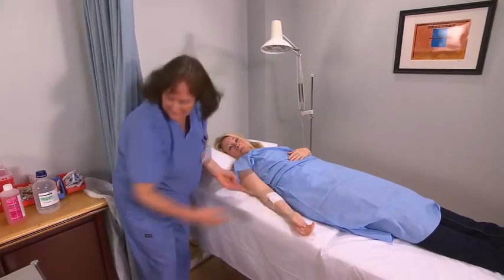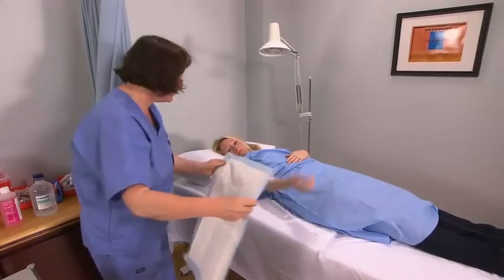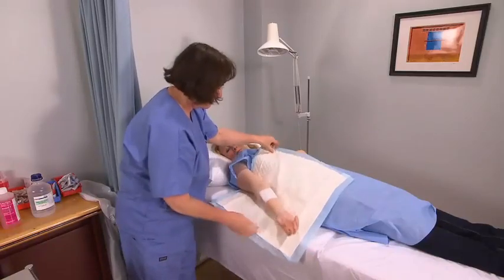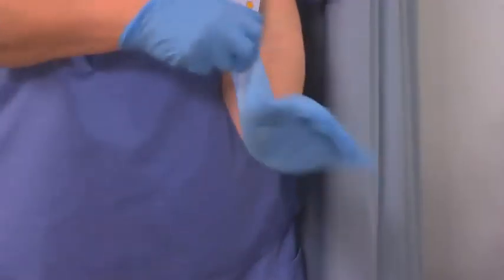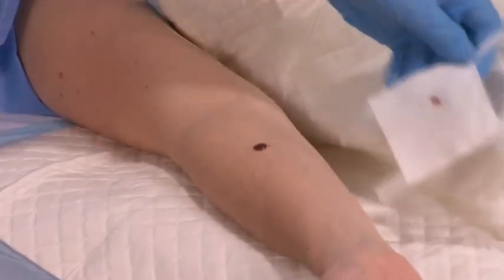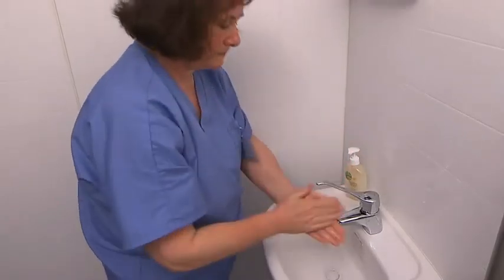Expose the site for surgery. Place a disposable drape under the region to be prepared. Ensure that a waste receptacle is nearby for collecting any used equipment. Put on non-sterile gloves and remove any gross skin contamination or dressing if necessary. Discard the non-sterile gloves and re-wash your hands.